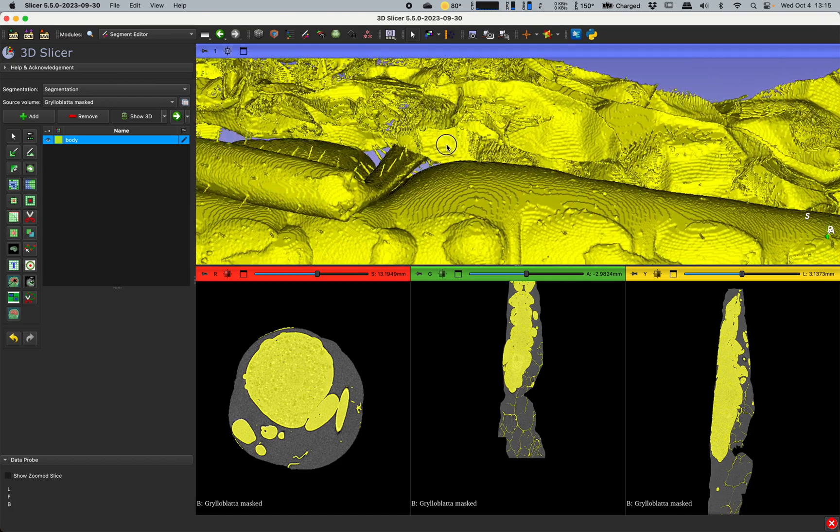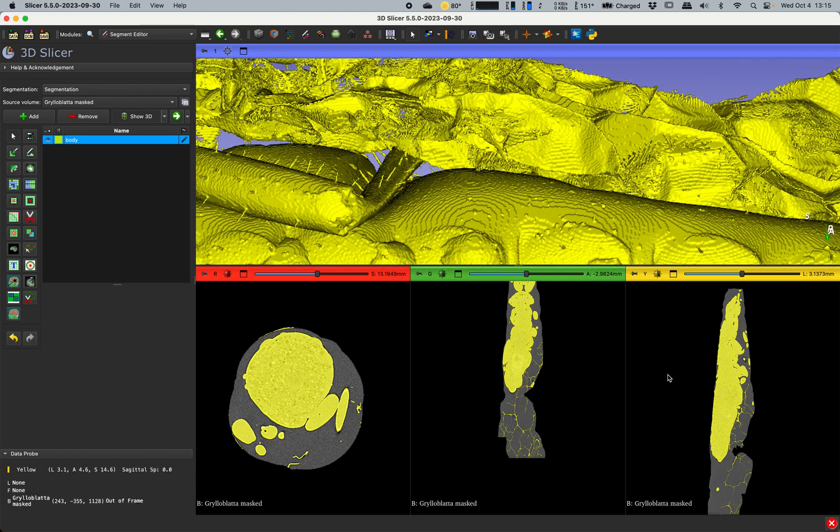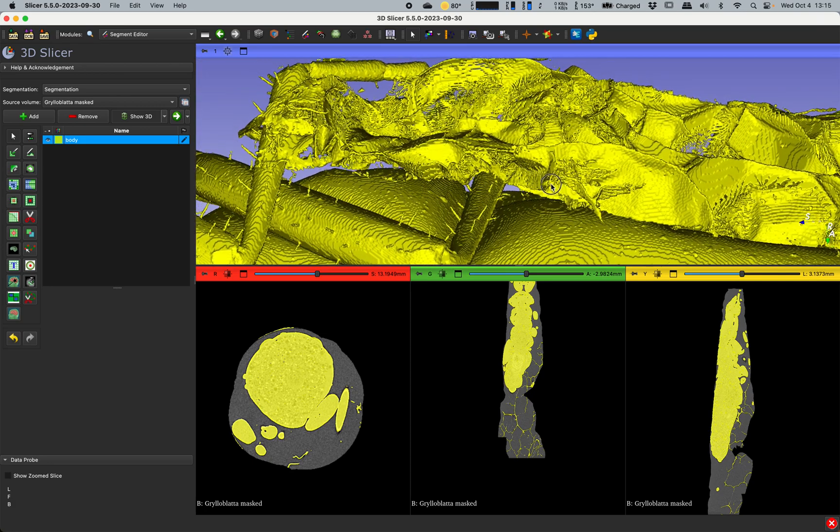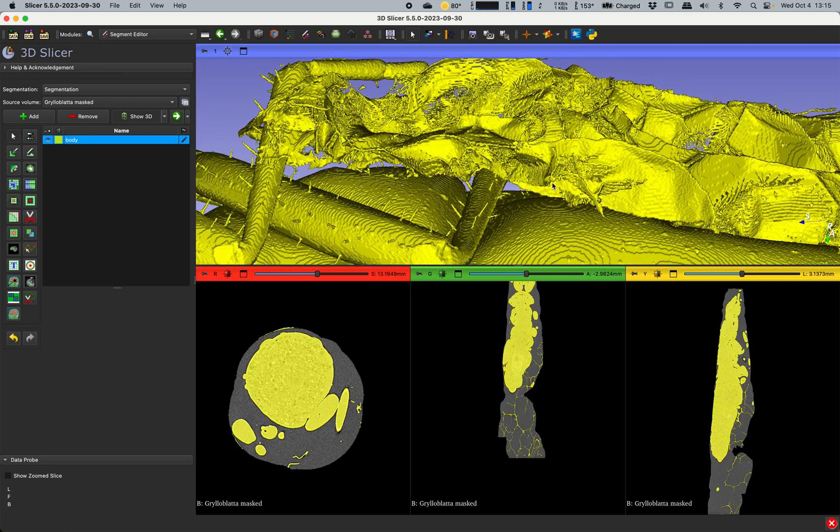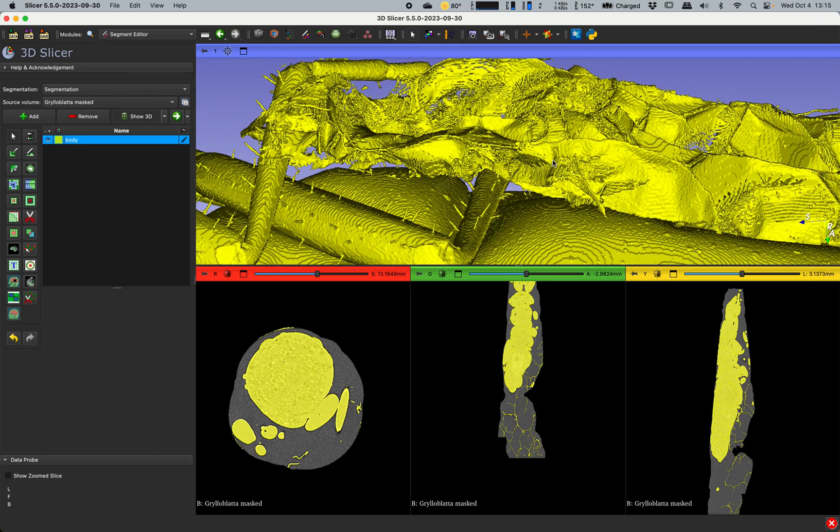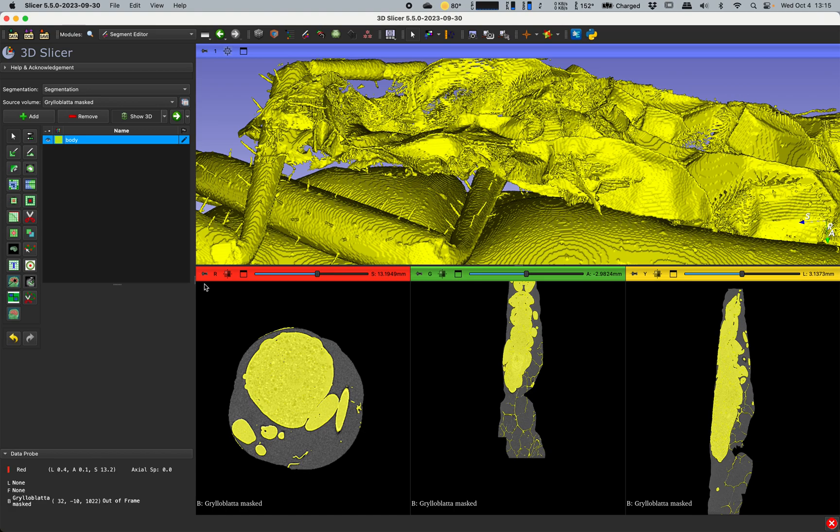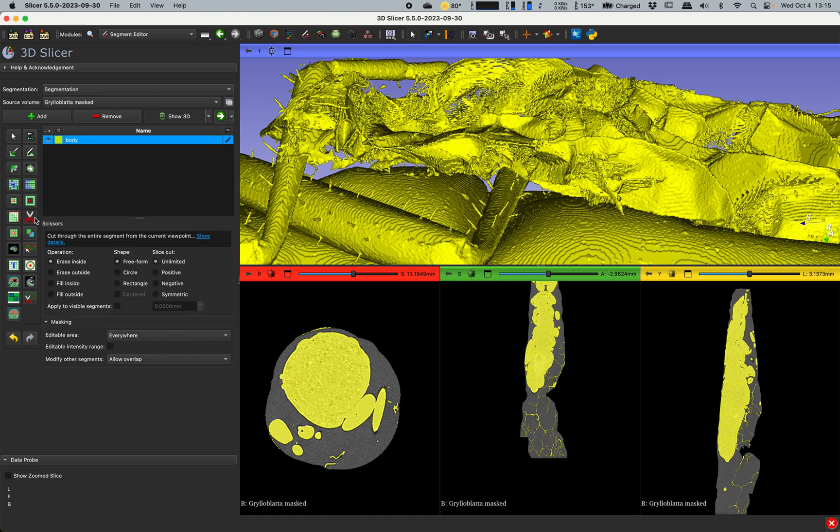So what I will do in this instance, there's all this packing material there that sometimes you can threshold out and sometimes not. For the sake of argument I will assume that this stuff we cannot threshold out right here. What I will do is I'll use a scissors tool.